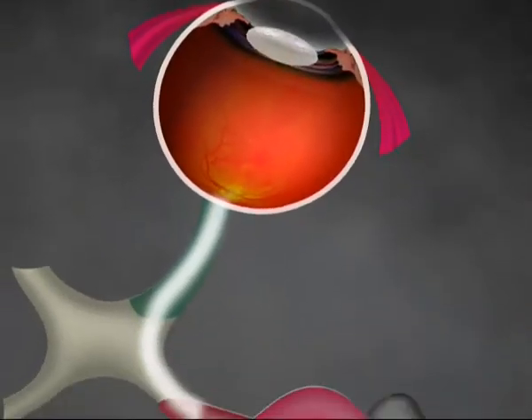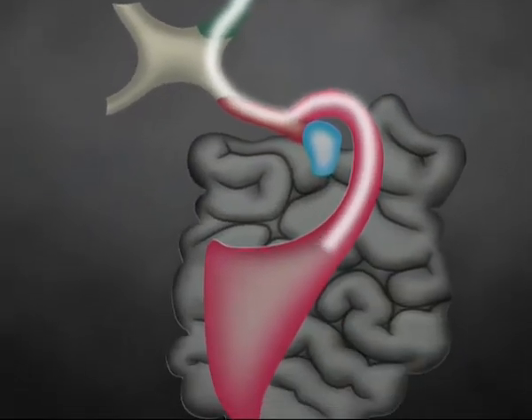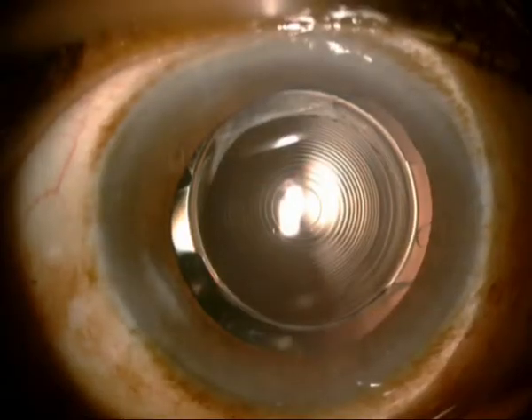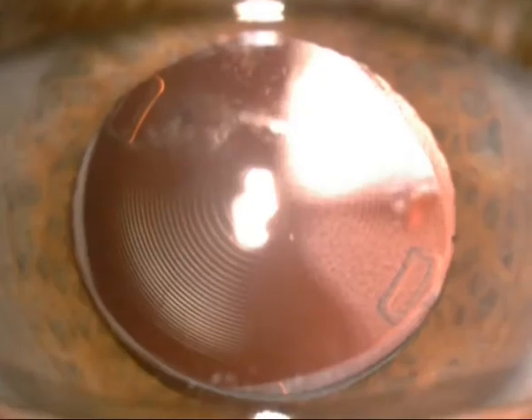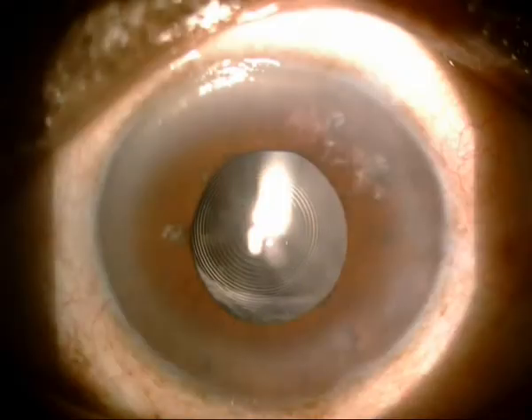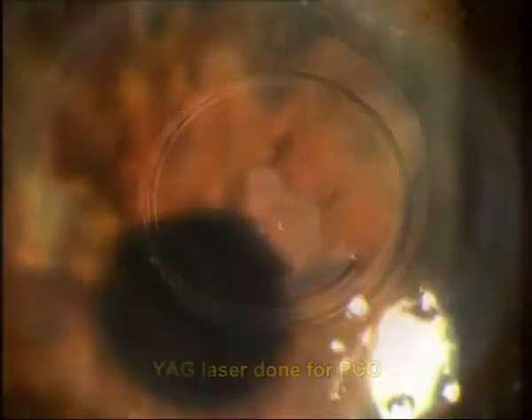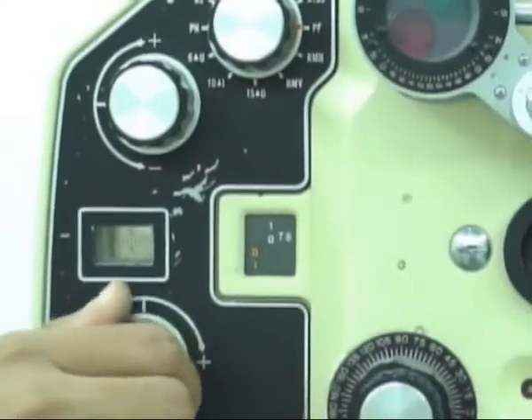One of the factors proposed to account for this difference in symptoms is varying degrees of neuroadaptation. Other factors include IOL decentration, retained lens fragments, posterior capsular opacification, poor ocular surface, and post-operative residual refractive error.